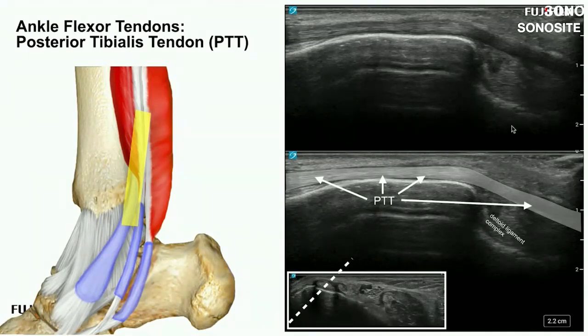And sometimes those layers are degenerated and have a more laminar look, and now you can move the ankle around and see the differences between those and if they're an issue or not. But I have seen old ligament degeneration look like some sort of synovitis because it was anisotropic in some cases and not anisotropic in other slices, and it looked like some proliferative synovitis coming out of the tibiotalar joint. But what it most likely is, is the degenerated ligament layers making things look like they're coming from the joint.